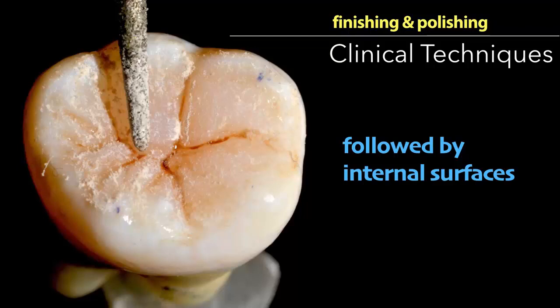Then the internal surfaces of the restorations are finished with the finishing diamond, in a very light and gentle way. You don't need to trim it. You just have to move it at a very slow speed, just to remove the overhanging composite there. You can do it in a dry situation, because if you do it dry, you can visualize. If you use water here, the details might be lost, and you might miss some things that need to be removed.